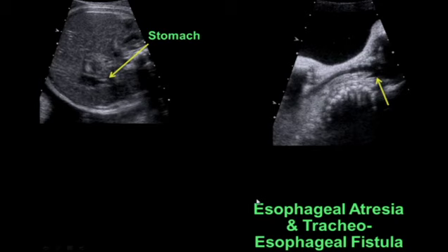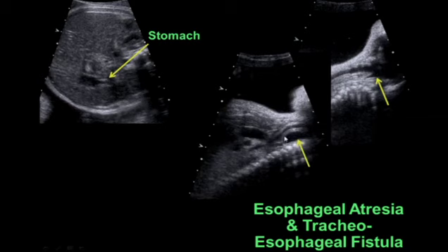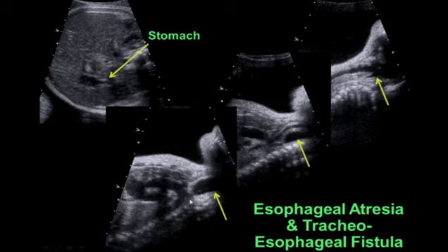This is another fetus with esophageal atresia. This fetus, though, had a tracheoesophageal fistula, so we were able to identify fluid in the fetal stomach. Notice the stomach in the left upper quadrant. There was only moderate polyhydramnios in this case. But what was interesting in this case is that we could identify the blind loop of the upper portion of the esophagus. This fetus had its neck extended, and we saw a little bit of fluid behind the trachea. And as we watched this fluid, we saw it expand and move inferiorly and expand a little bit more, but not travel any more inferiorly. So this is fluid that the fetus has swallowed, but is obstructed at the level of the atretic portion of the esophagus. So this fluid will then track back out into the amniotic space.